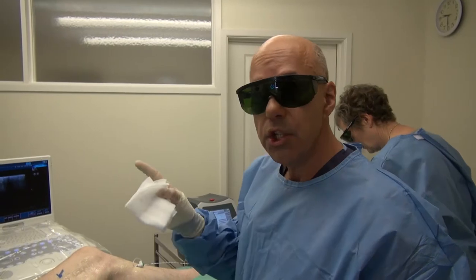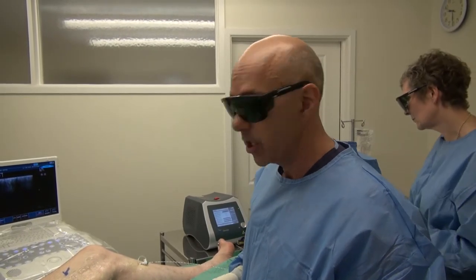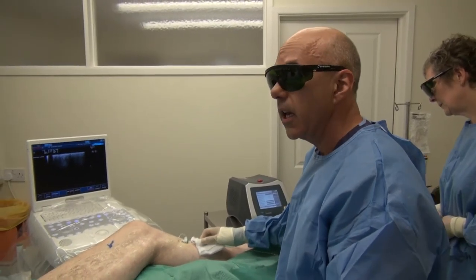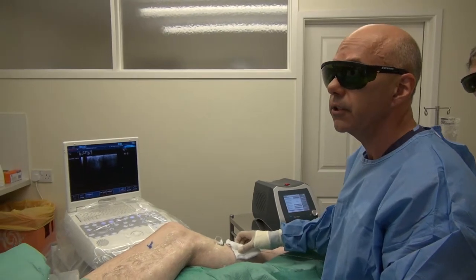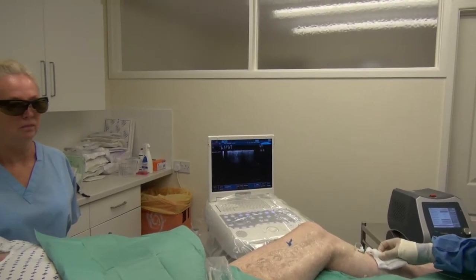If there are any problems, Jane is in charge of turning off the laser and she's in charge of safety. So at any time, if you feel discomfort, I want to know, and the best way to let me know is to say in a loud voice: ouch.